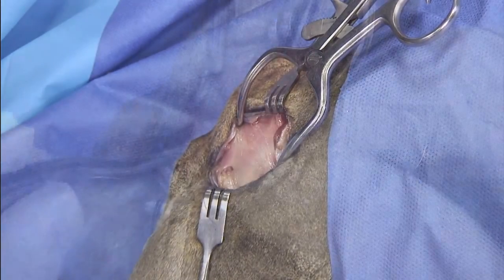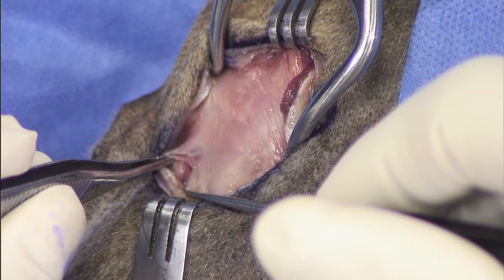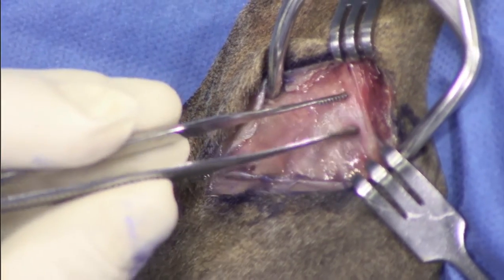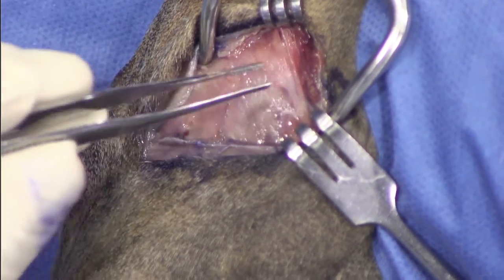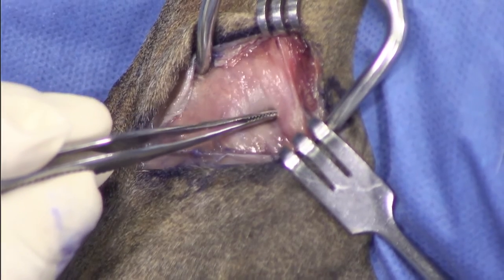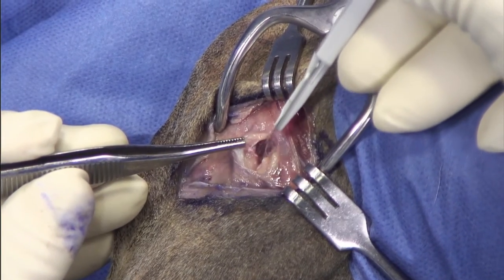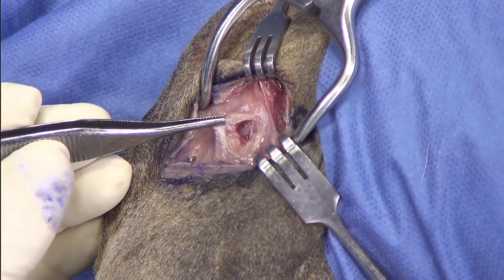Once we open the extensor groove and we know for sure where the digital extensor is, we can palpate it immediately, cranial to the groove to give you some orientation. When I'm palpating here with the forceps, this is the fabella — I'm putting some tension on the bone. I want to go immediately distal to that in this tissue, just distal to the fabella, and incise it until I can see with the mosquito the back of the condyle.